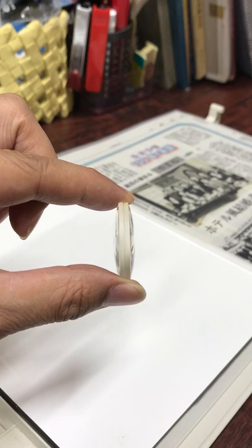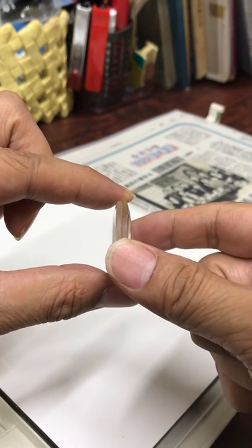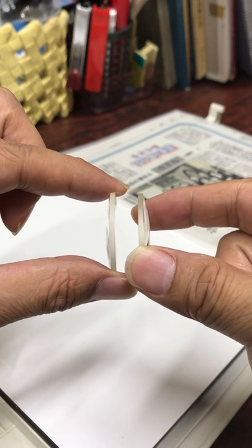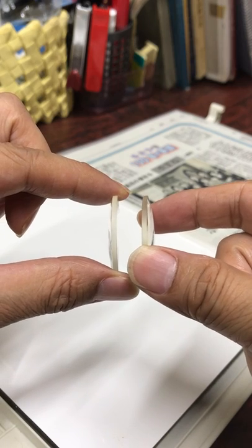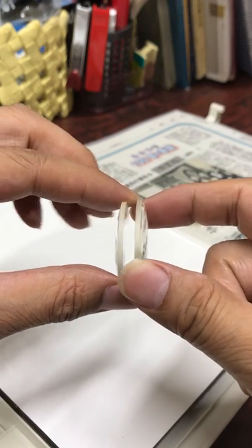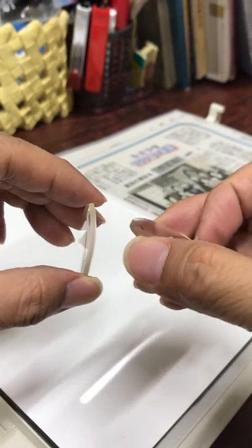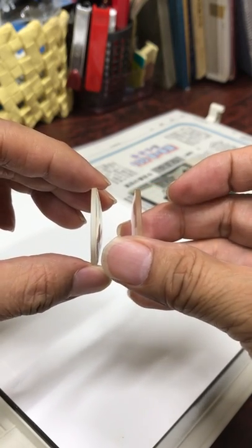This is a convex lens of 20 diopter. I cut this convex lens of 20 diopter into two parts. Each part of the lens has 10 diopter and 10 diopter. Then I make these parts inside out and combine these parts again.